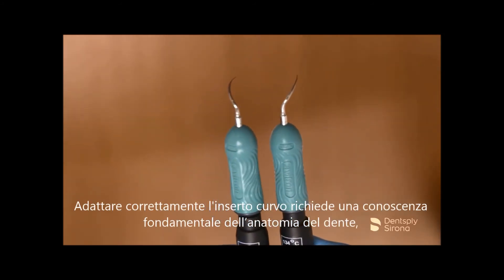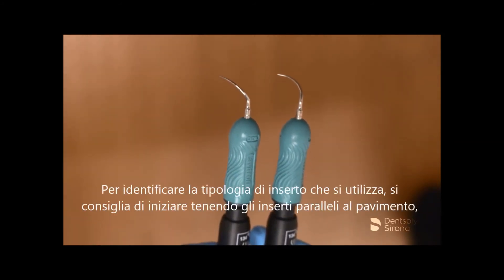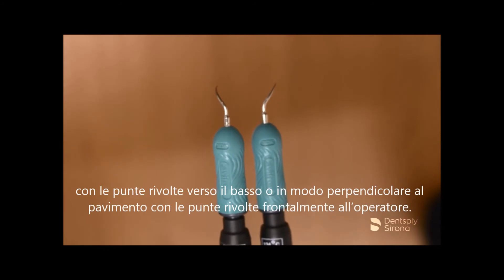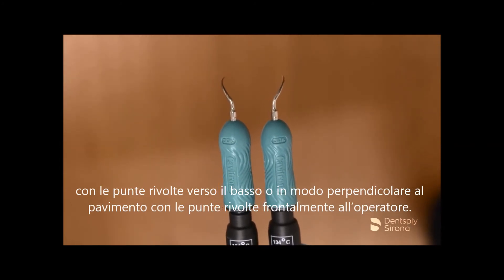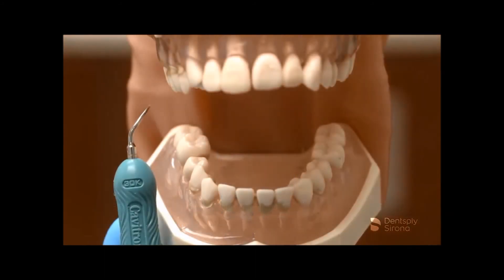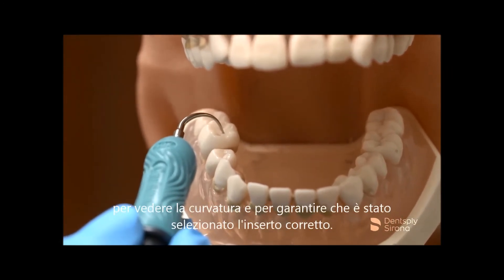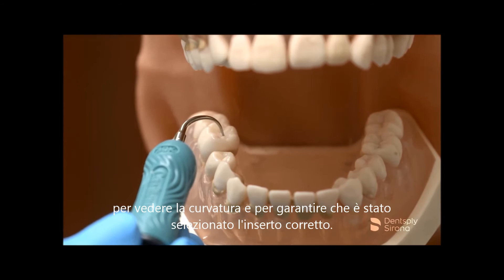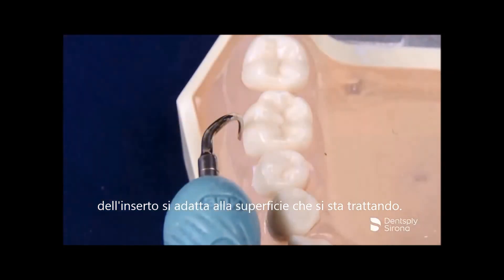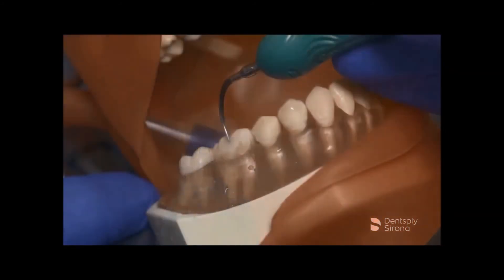Adapting the curved insert properly requires a fundamental knowledge of the tooth's anatomy and proper placement on the appropriate tooth surface. In order to identify which insert one is holding, it is recommended to begin by holding the inserts parallel to the floor with the points facing down, or perpendicular to the floor with the points facing away from the clinician. The right insert will curve to the right and the left will curve to the left. It is also helpful to place the insert on the occlusal of the intended tooth to see the curvature and ensure you selected the correct insert. After this is established, maintain a vertical approach and notice that the back of the insert is adapted to the surface you are entering.